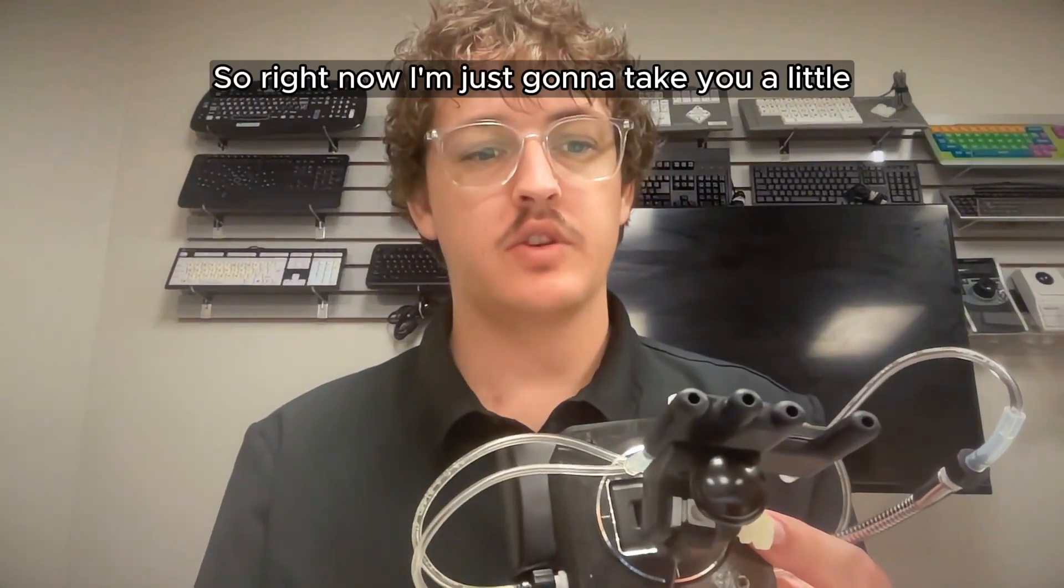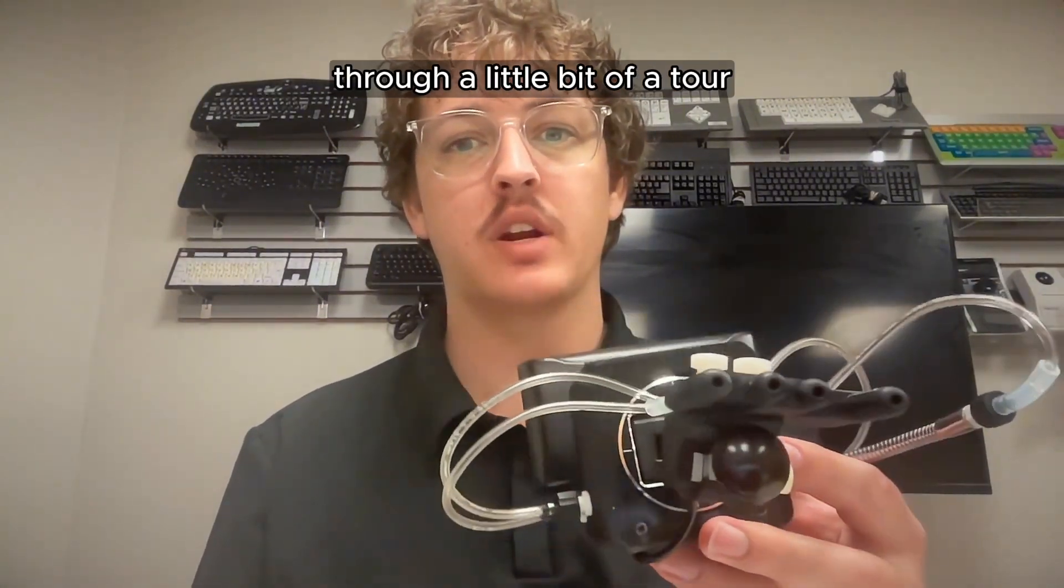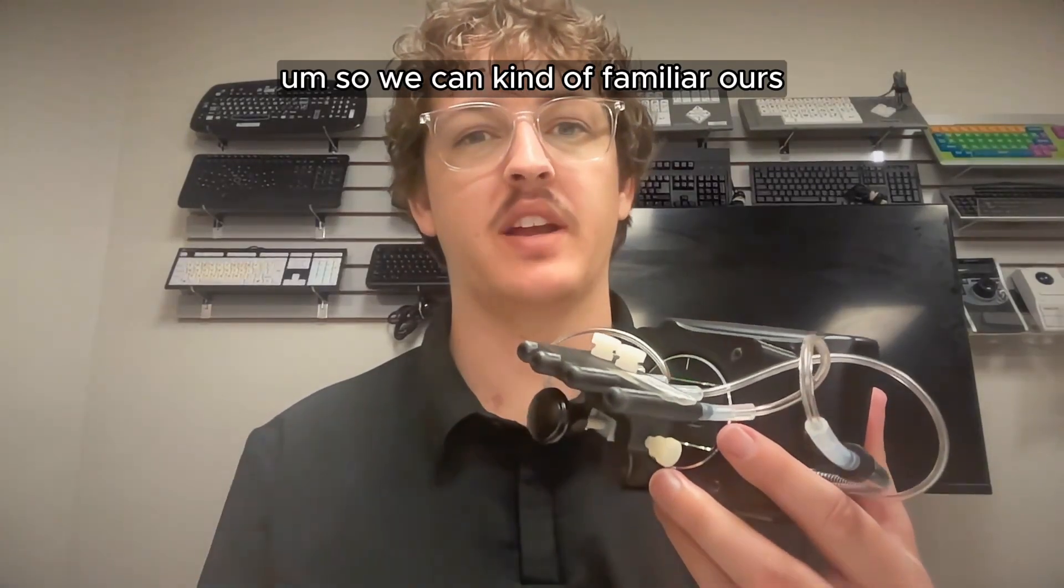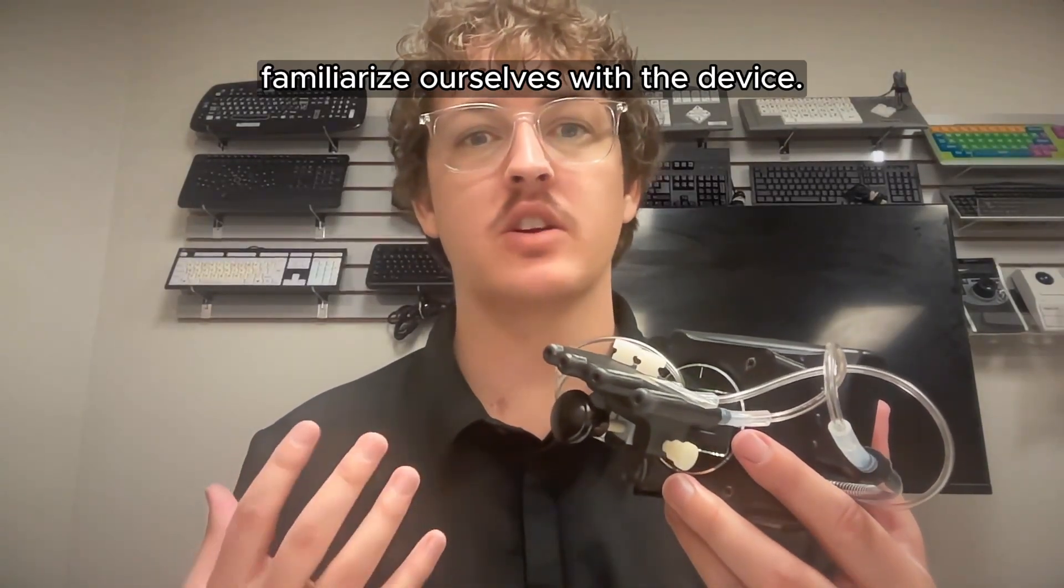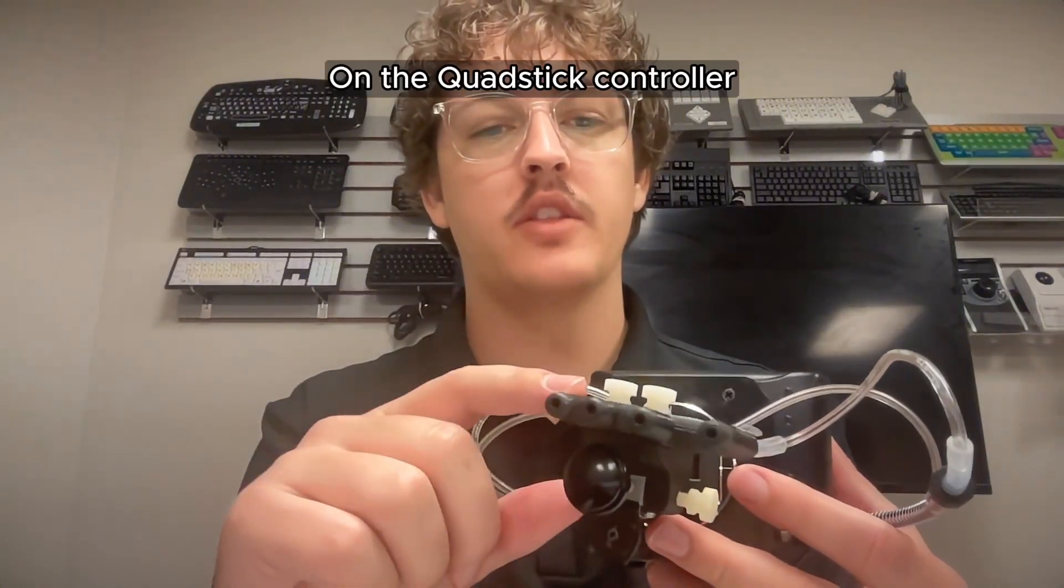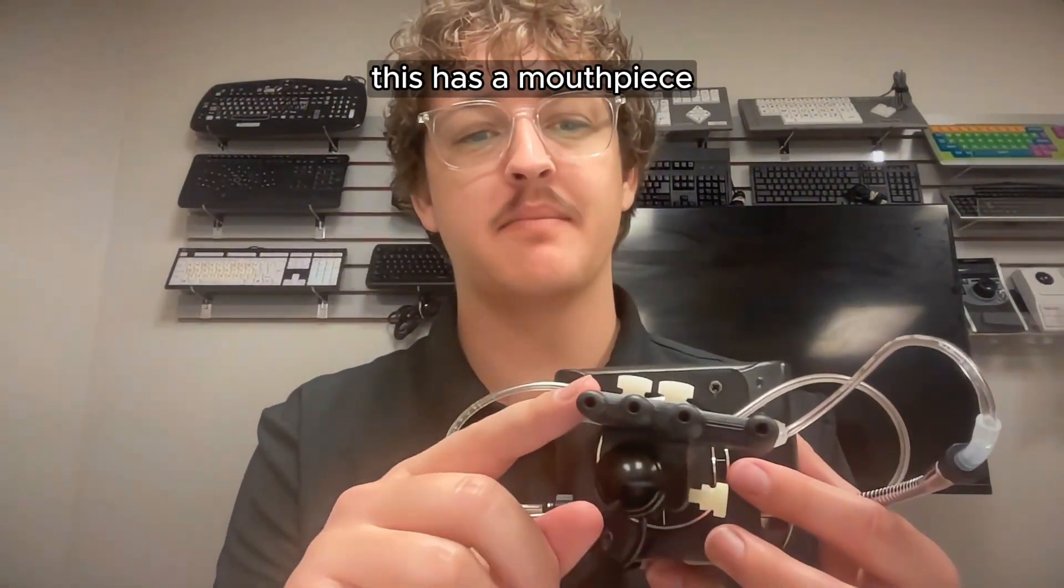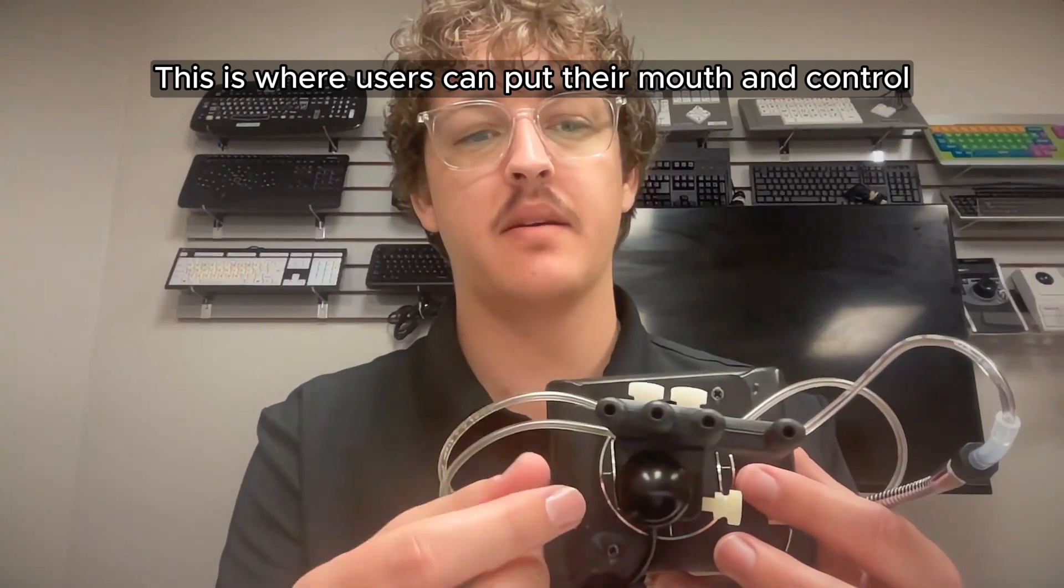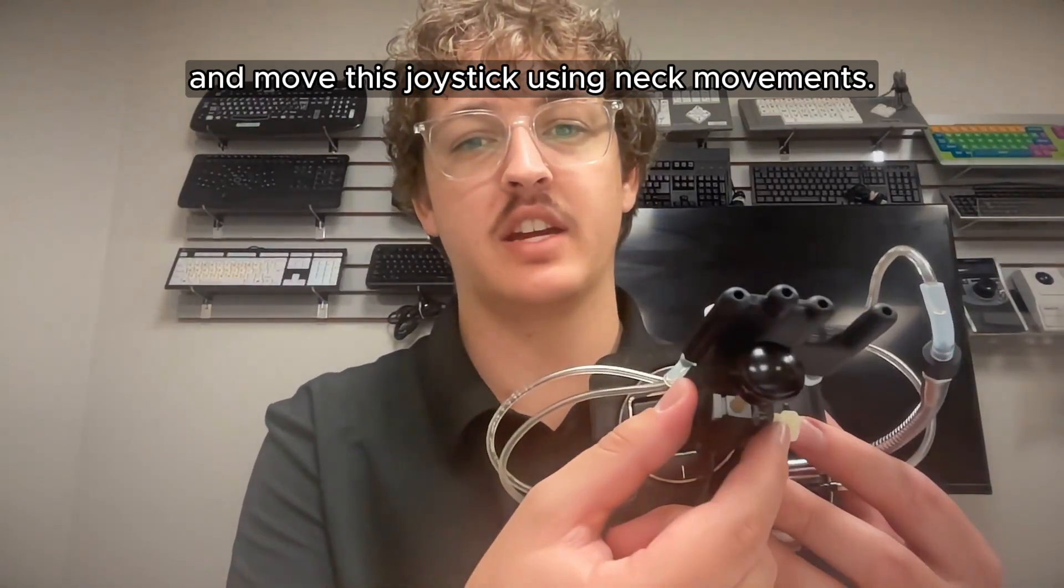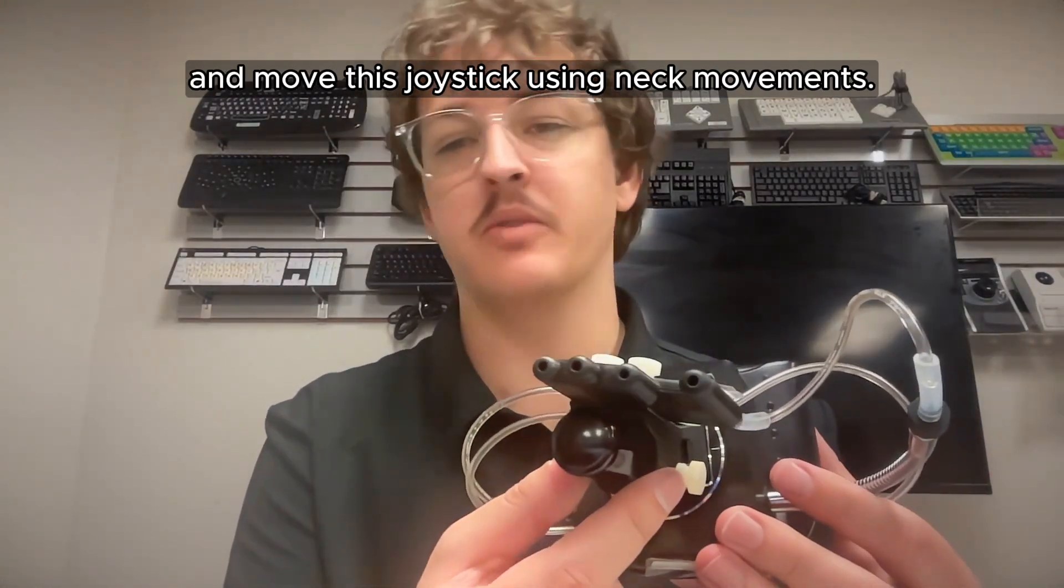So right now I'm just going to take you through a little bit of a tour of the QuadStick controller so we can familiarize ourselves with the device. On the QuadStick controller, this has a mouthpiece. This is where users can put their mouth and control and move this joystick using neck movements.